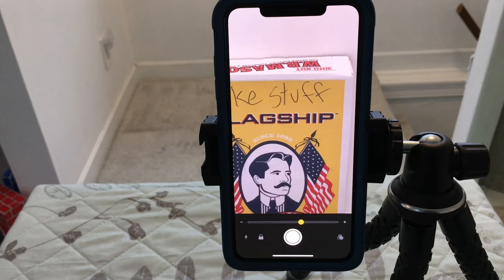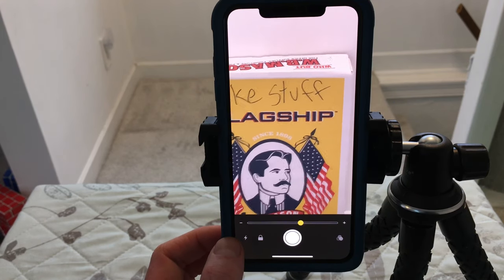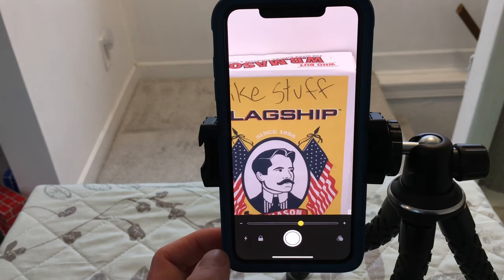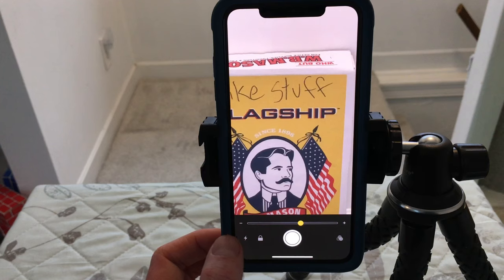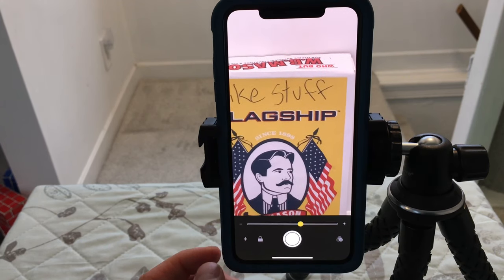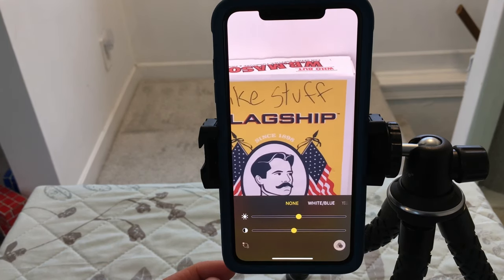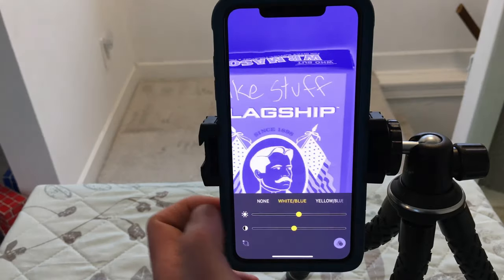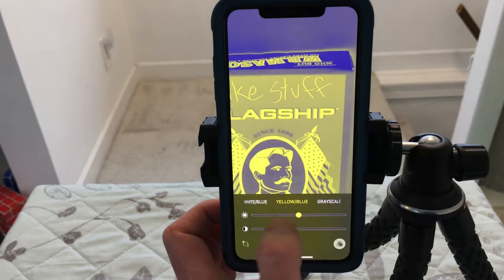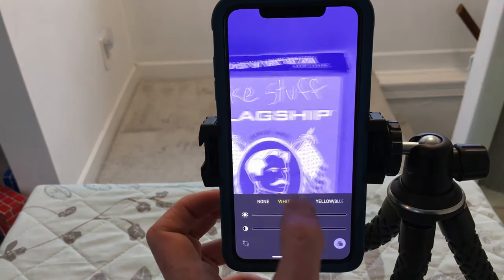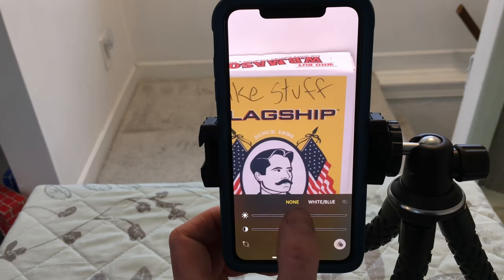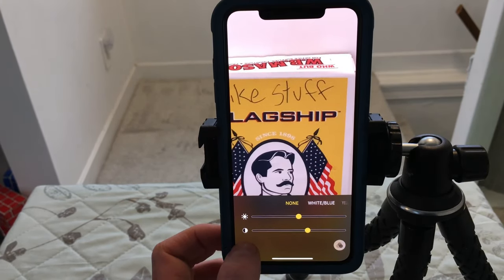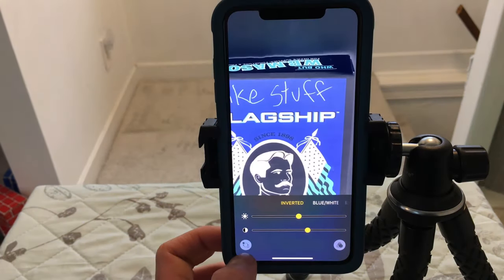Another feature is a tab to turn the camera light on or off. If you tap it, it turns the light on; tap again, it turns the light off. In a dim area that could be really helpful — say in a restaurant where you're trying to read a menu. Then there's the bottom right tab that looks like three circles; that gives you the option to change different contrast and color settings. There's white-blue, yellow-blue, grayscale, and quite a few others worth looking through to see what might work best for you. You can also change the brightness and contrast.